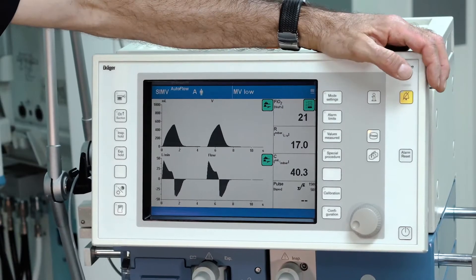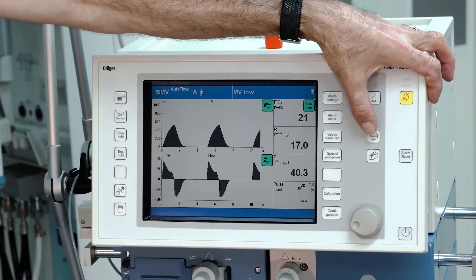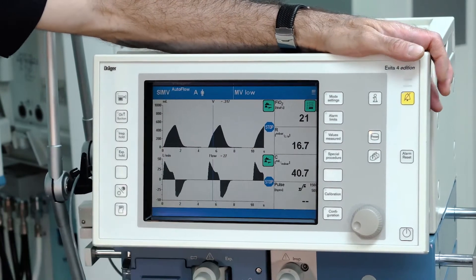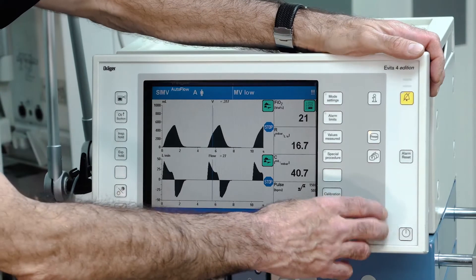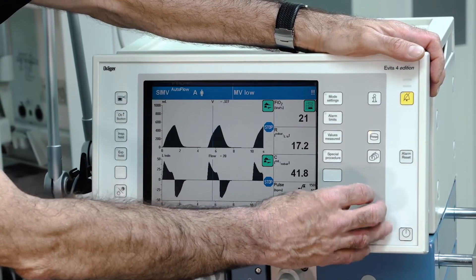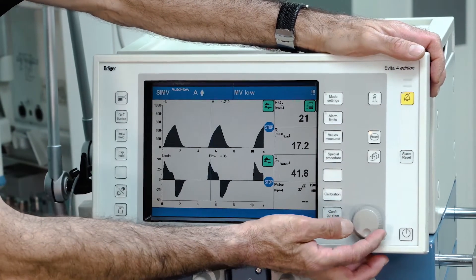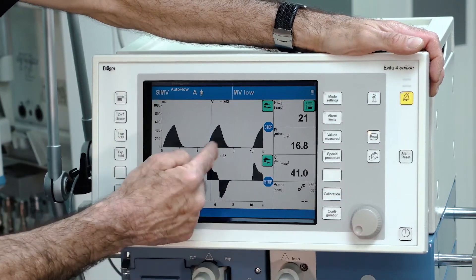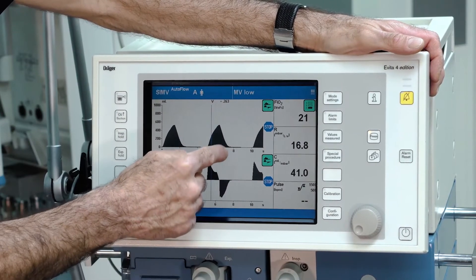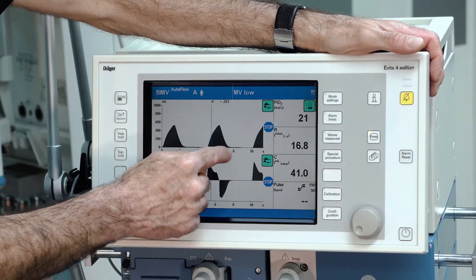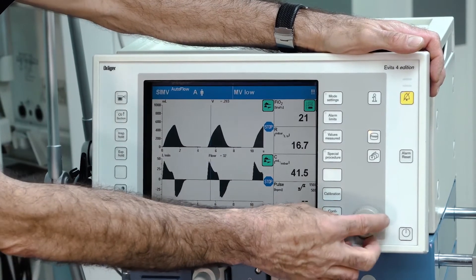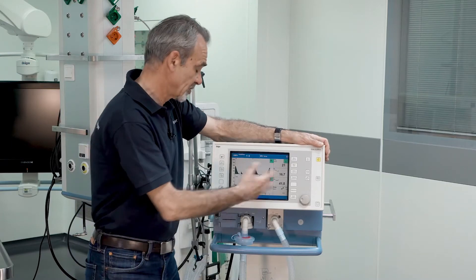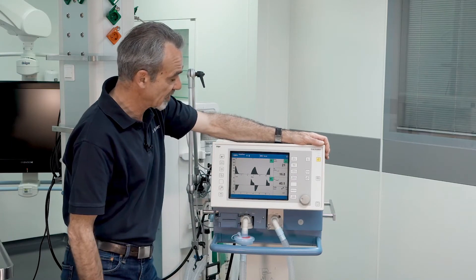To freeze the waveforms, just push the freeze button. The waveforms are now frozen and you can use the cursor by turning the rotary knob to see the values of the measured curve at the cursor position. Pressing freeze again stops the freeze function.